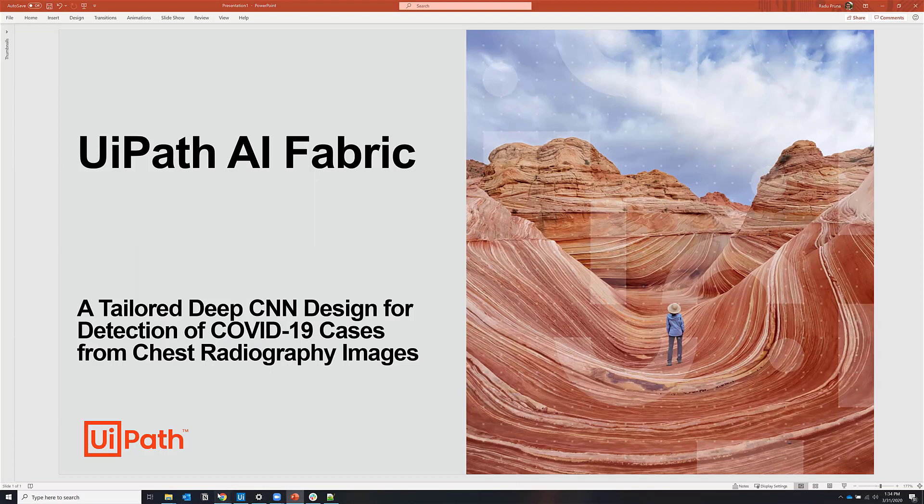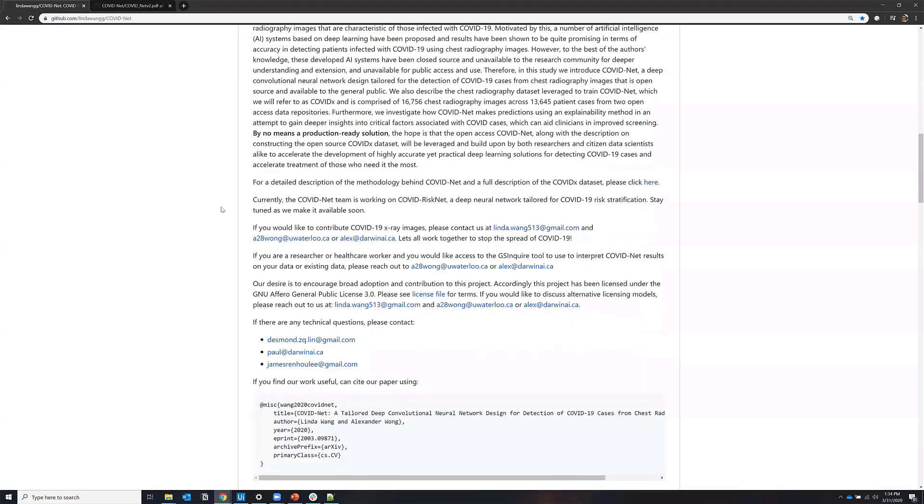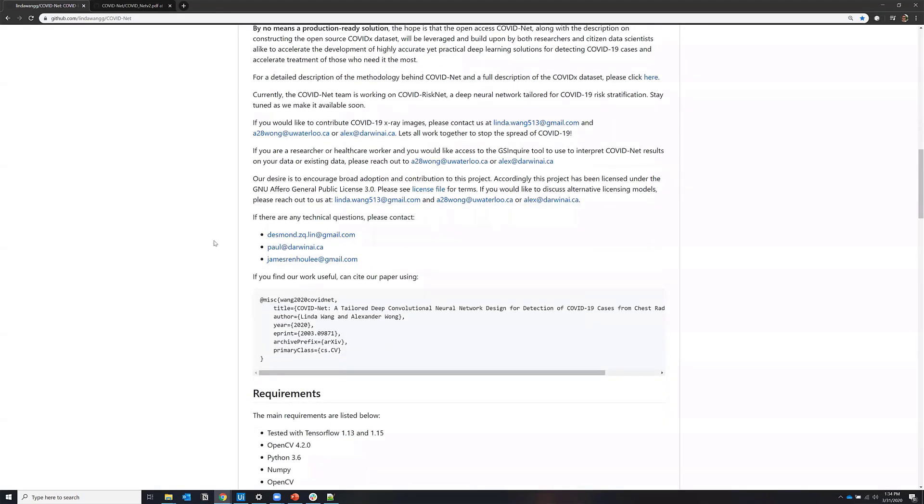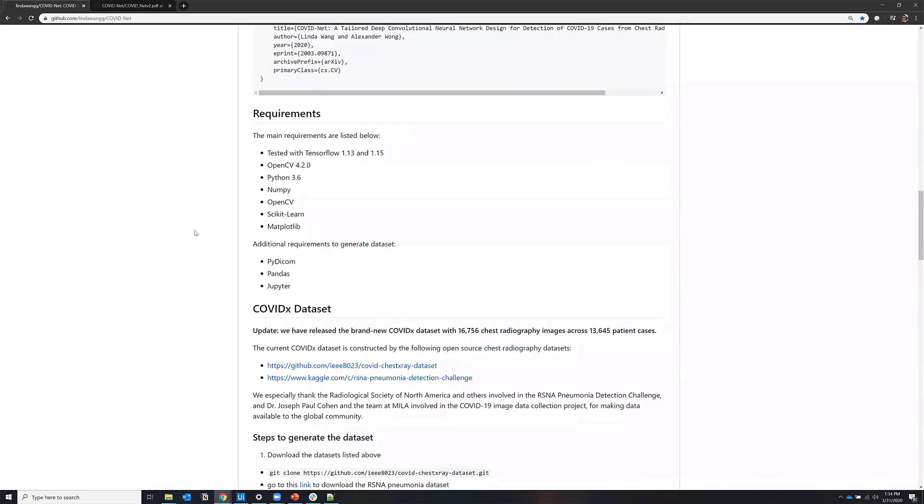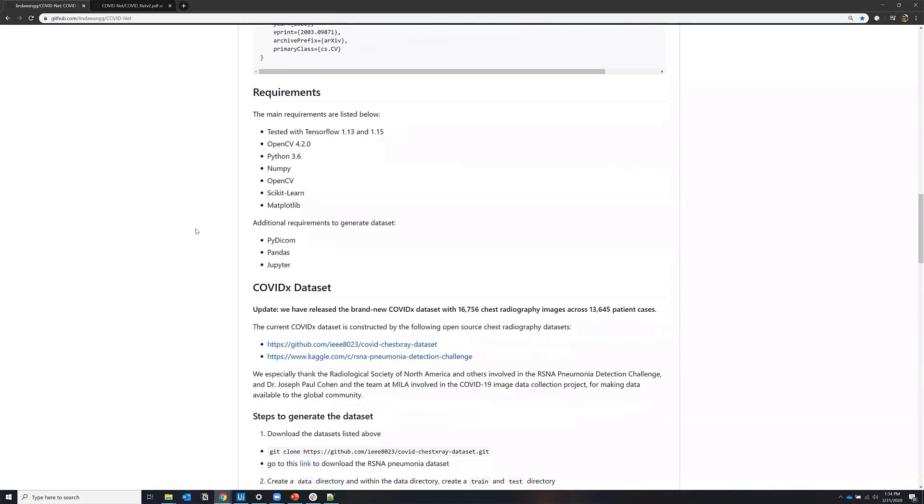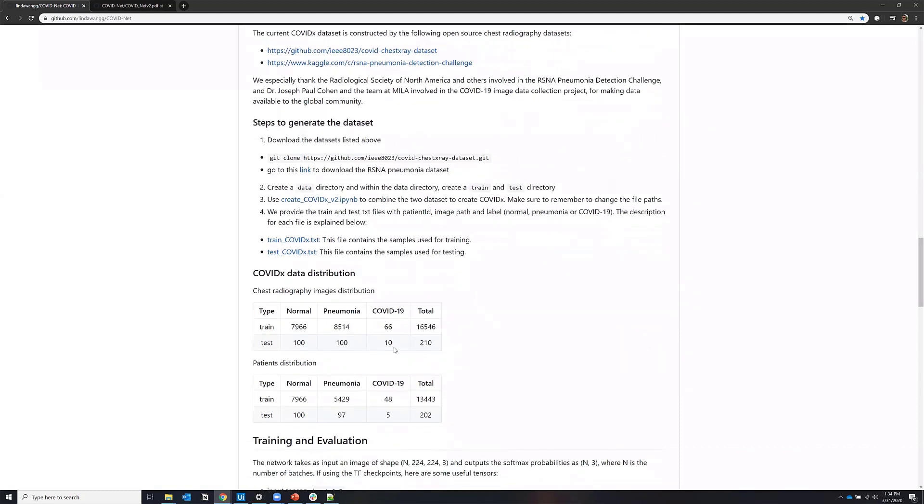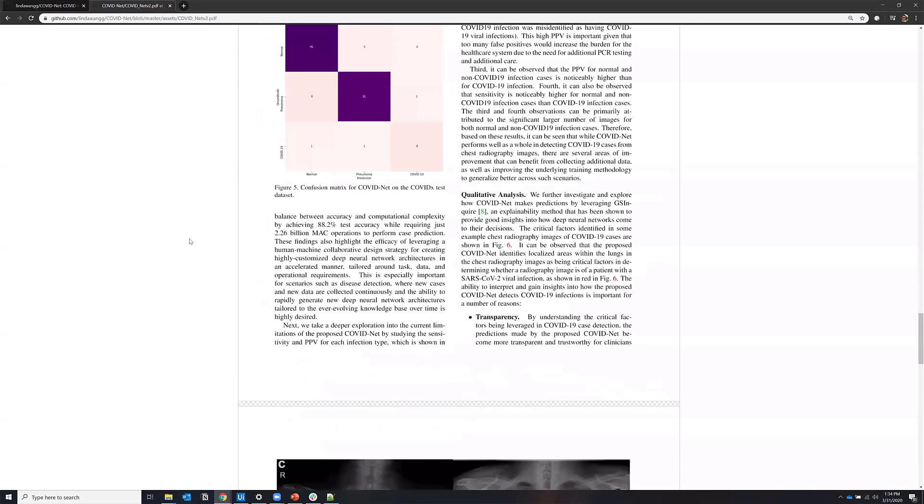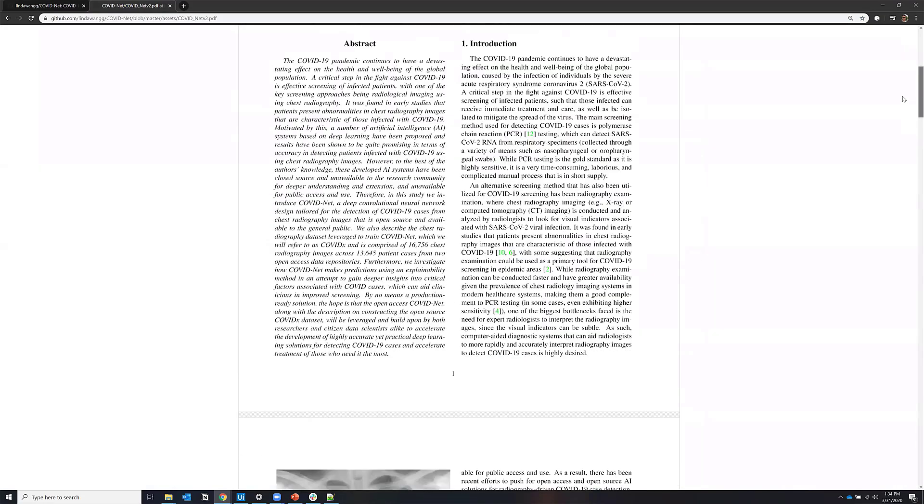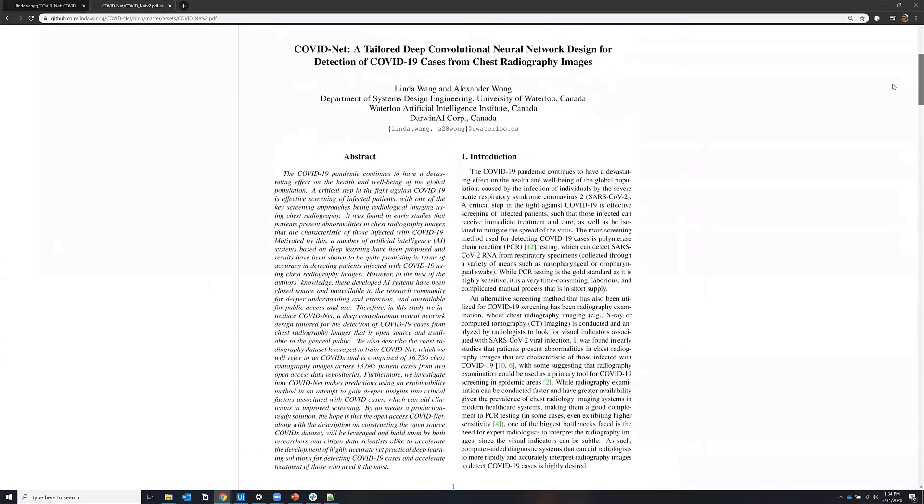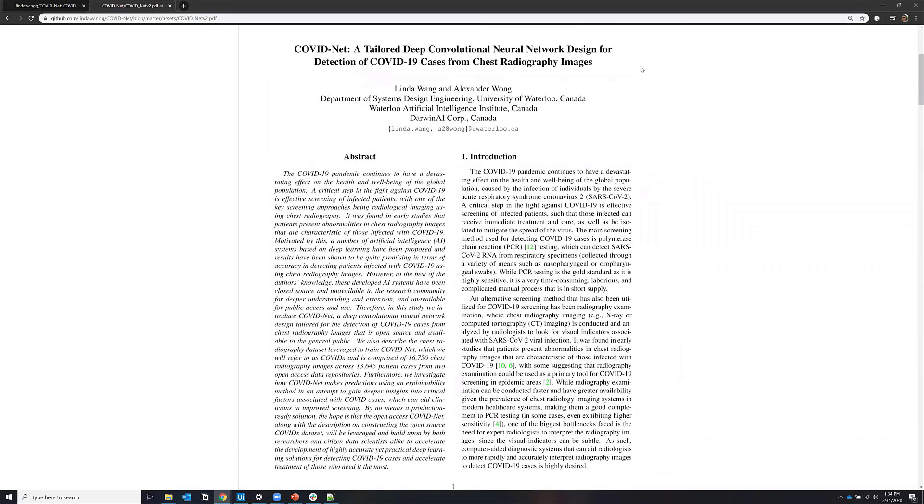The ML model itself comes from an open source initiative led by researchers at University of Waterloo and Darwin AI and has been trained on a publicly available dataset that consists of only 76 images from patients with COVID-19. The dataset, the models, architecture and the experimental results are fully described in this paper.